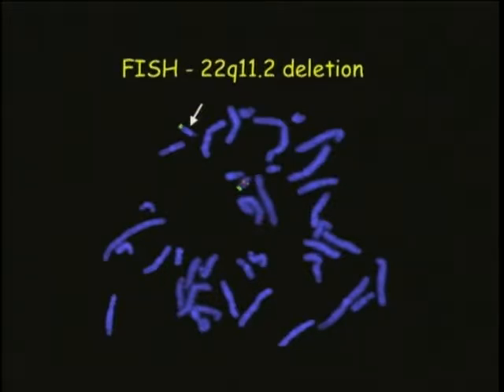And so now we have dozens of probes in the clinical lab that cover not only all the microdeletion and duplication syndromes, but also the subtelomeric regions, because we know that rearrangements in the subtelomeres often give rise to mental retardation. And we also have probes that cover most of the rearrangements that are seen in hematolymphoid disorders.